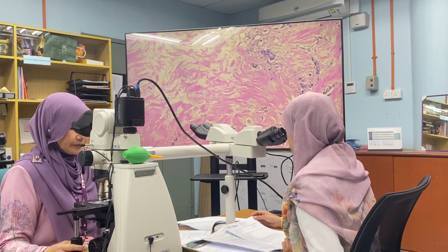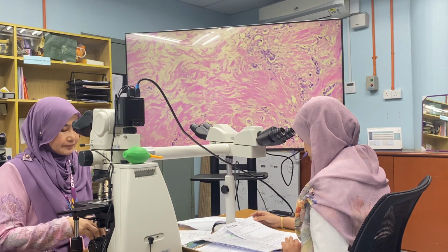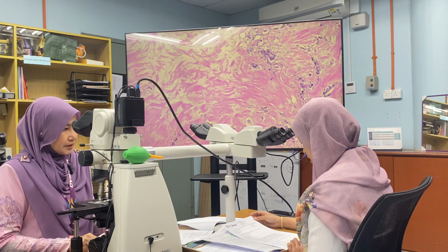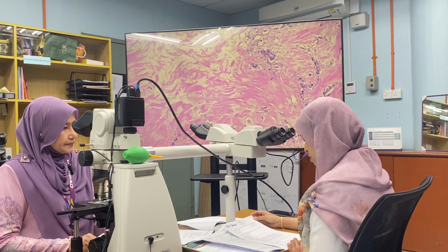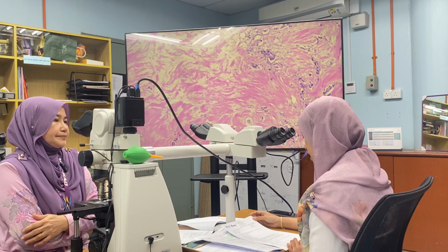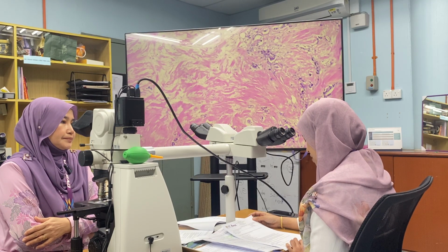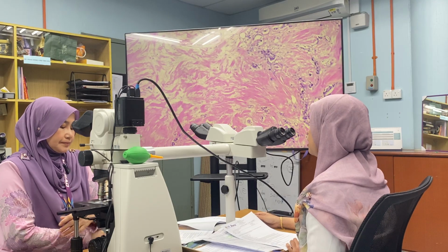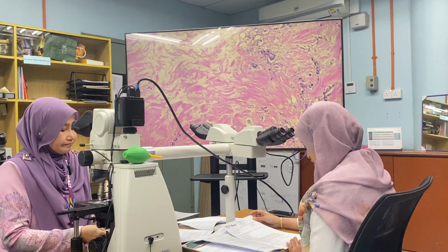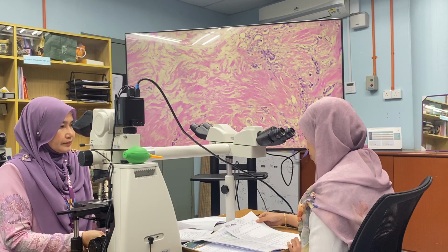From those microscopic findings, what is your interpretation for this case? For this case, I conclude it is an invasive breast carcinoma, no special type. For the staging, ypT2, because the tumor size is 40 mm, and for the Miller-Payne grading, I think it is about 30% viable tumor, so I score it as 2. The axillary lymph node is positive, so N1.